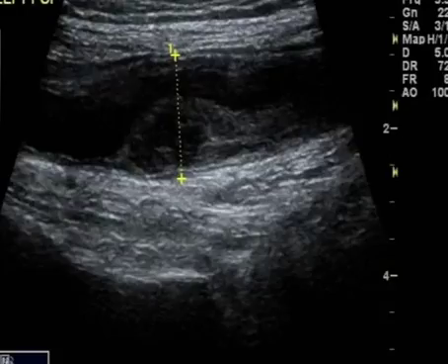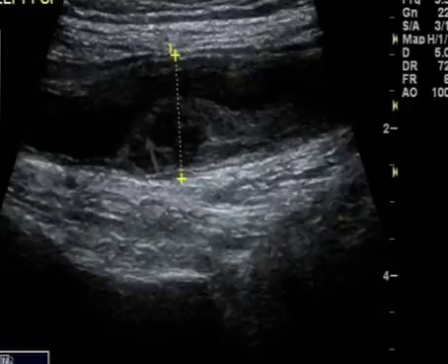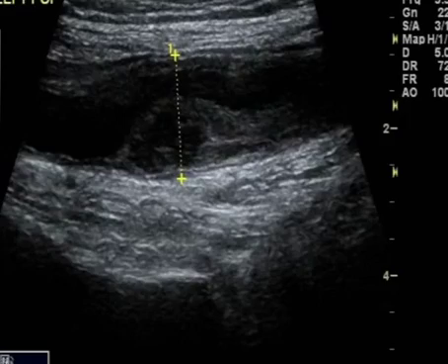patient. Here's another example, a popliteal artery aneurysm where we've measured the diameter of the popliteal artery. In this case, it's about 1.6 or 1.7 centimeters. And this is the example which shows all this thrombus in here that puts the patient at significant risk for microemboli.